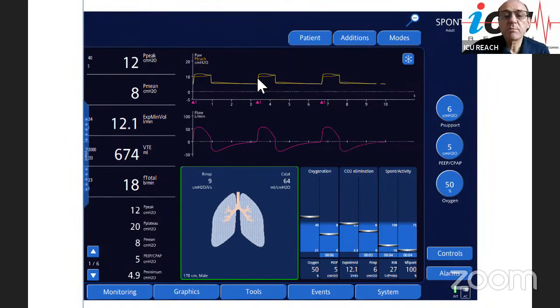The ATC pressure is added to the circuit here, and that pressure goes up higher than the orange line. This is the pressure that is added at the start of inspiration. But notice it goes down gradually after that. It is a small percentage because you don't need much pressure.